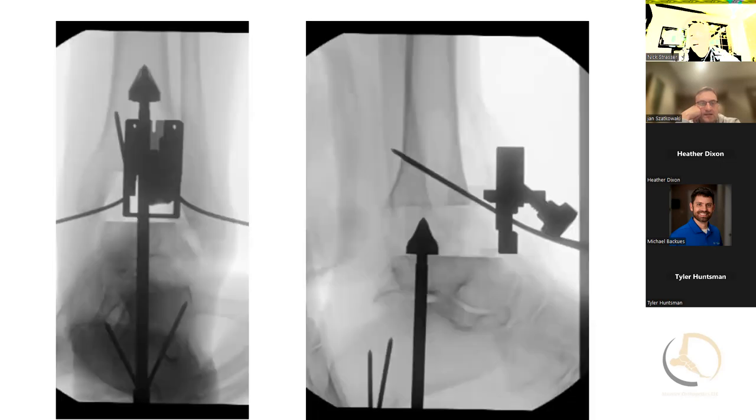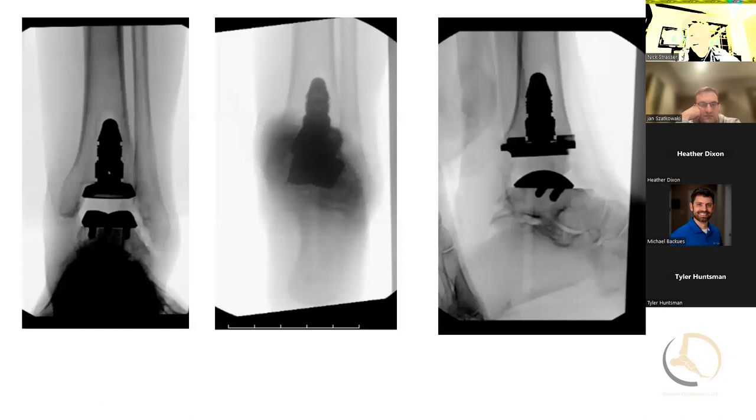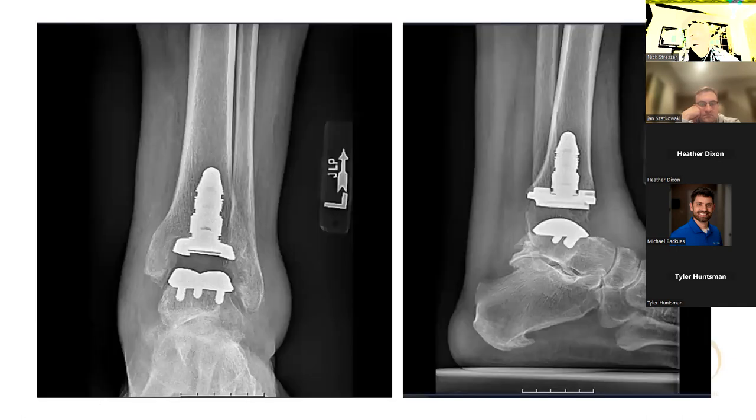Going through here — even here you can see I'm pretty posterior in the talus with my reaming. They talk about trying to be more over the lateral process of the talus. My foot's pretty anteriorly subluxed, so it ended up a little more in the posterior aspect of the subtalar joint than I would like. After insertion of the real components, the alignment actually looked pretty good in this case — overall pretty pleased. At six months, overall doing well and pretty pleased with how this one turned out.